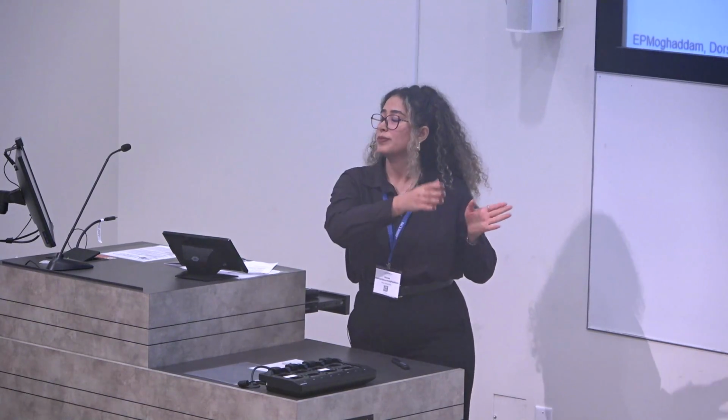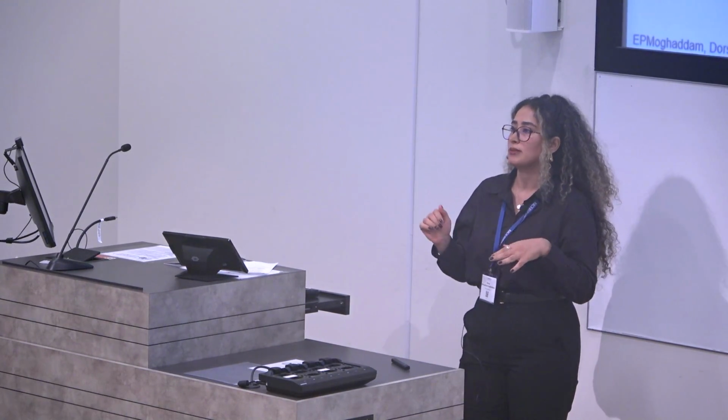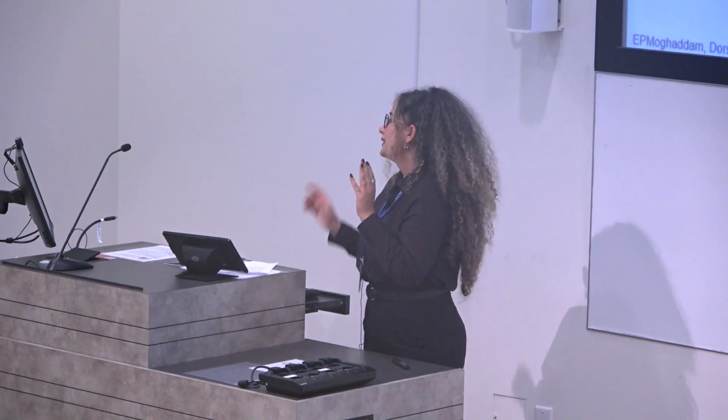No, we don't do any post-processing after the model, if that's your question. We do perform some noise removal before actually working with the signal, just to get rid of baseline noise and other movement and motion noise like that. But we don't do any smoothing at the end of the process. My question is, is your model doing that? The encoder-decoder part, I don't think that they do that, not for this application. I know that it can be used for noise removal, but I don't think that my model is focused on doing that here. Okay, thank you.